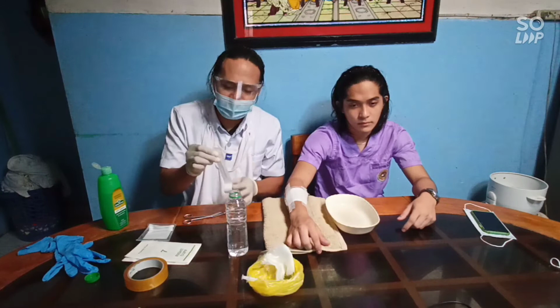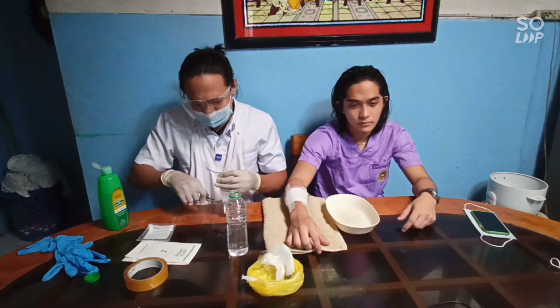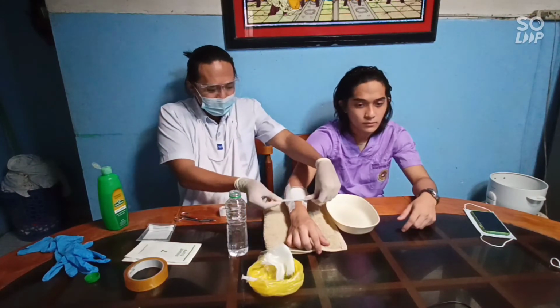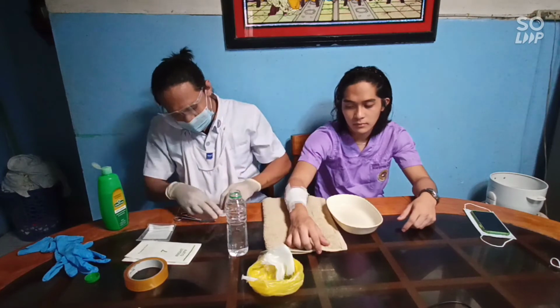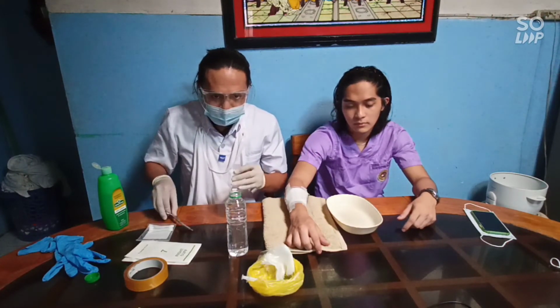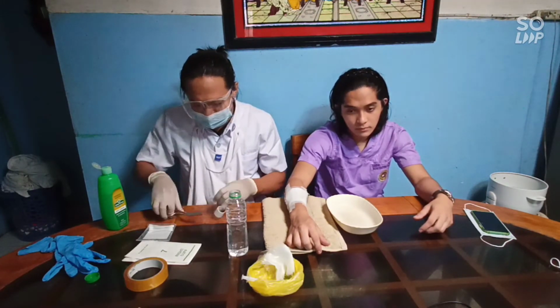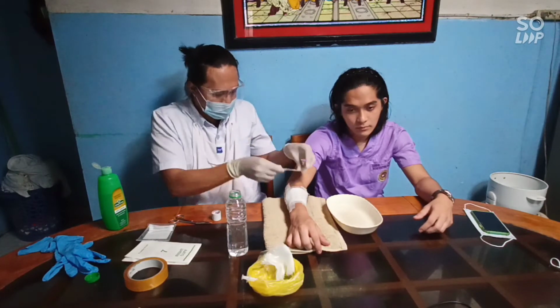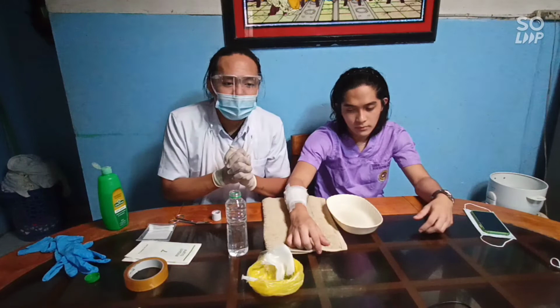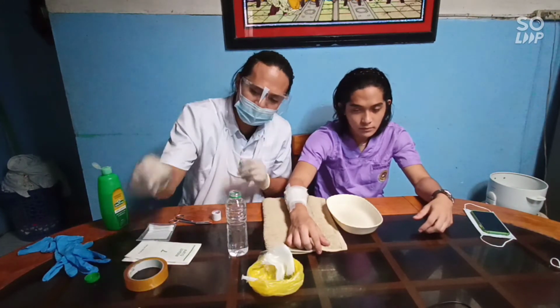We need to secure it so that it will not fall off. And then label with time, date, and the nurse's initials.